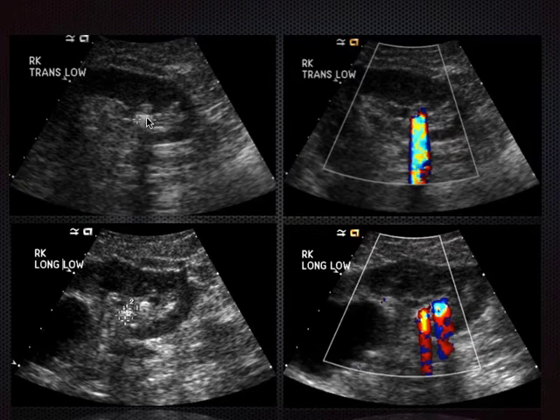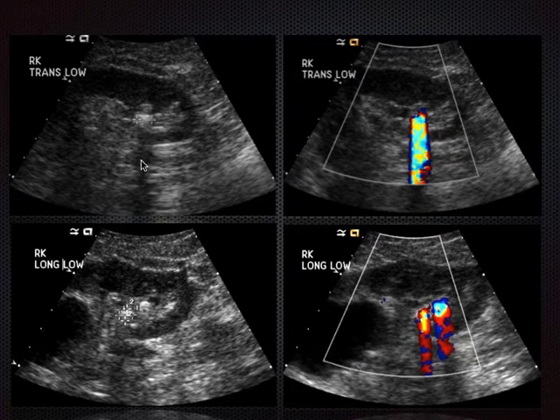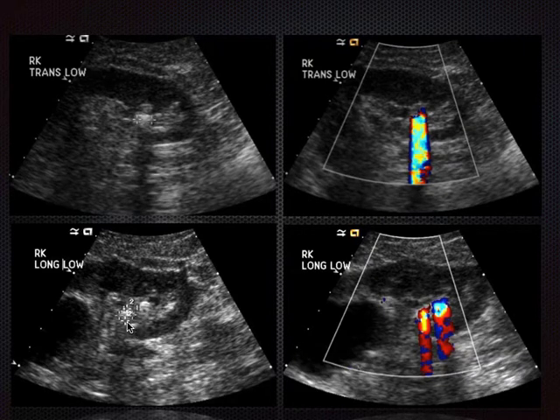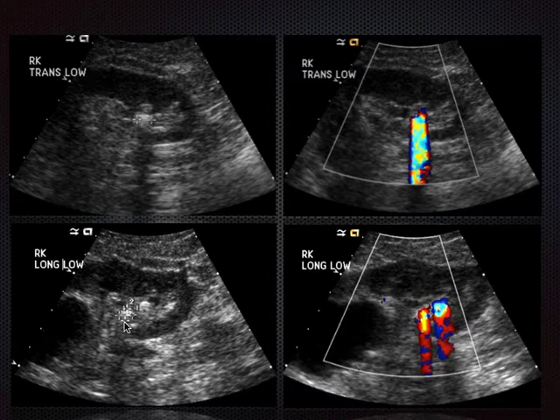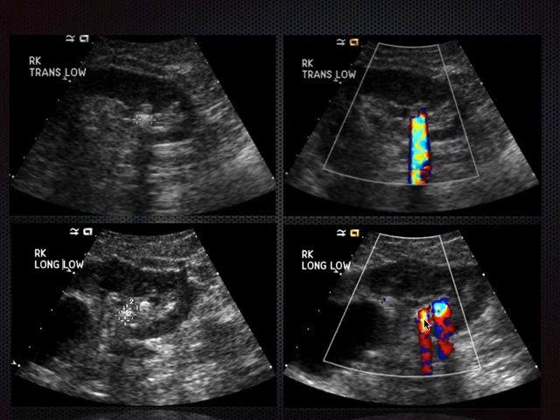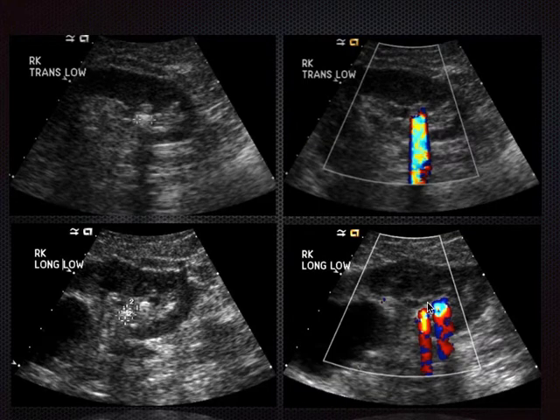What we're looking for on ultrasound is a bright echogenic structure with a clear posterior acoustic shadow—attenuation of the sound beam. But frequently after lithotripsy or even ureteroscopy, some of that dense shadowing is lost because we're dealing with small particulate sand or stone fragments. Putting on the color Doppler can enhance the visibility of stones and confidence when you see this twinkling artifact.